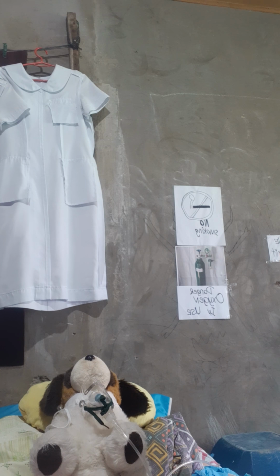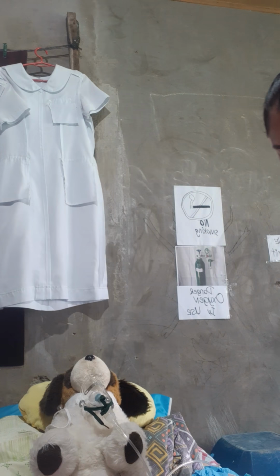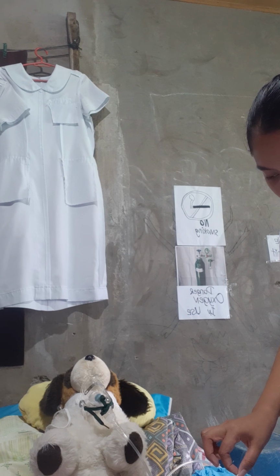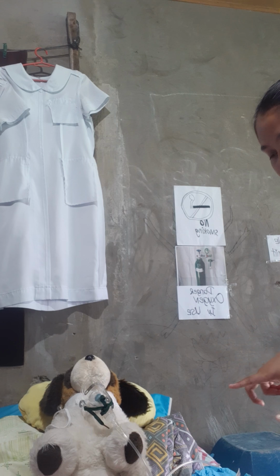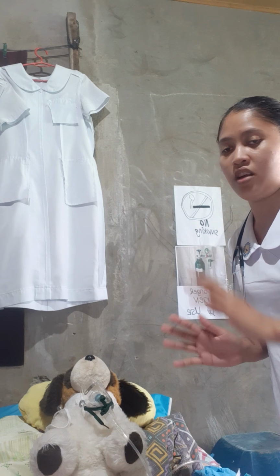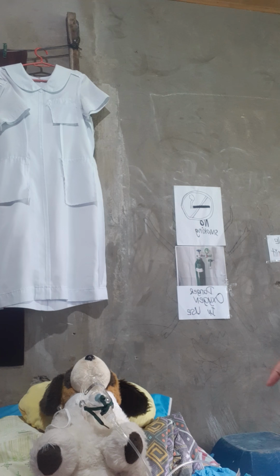Then afterwards, in cleaning the tracheostomy and non-disposable inner cannula, first we need to prepare the supplies or materials. Prepare the tracheostomy care kit in the box. If applicable or available, we need to open it and separate the contents in the basins. We need to make sure that we do not touch the inside, just the edge, because it is sterile.